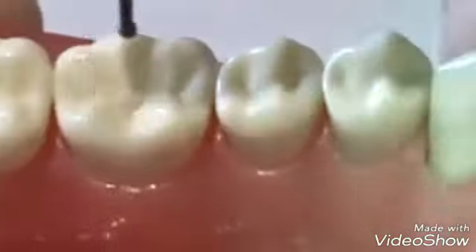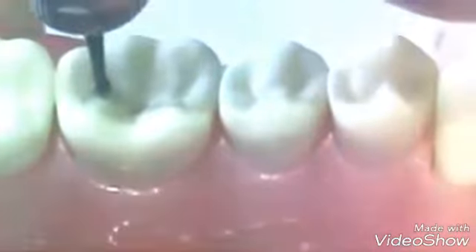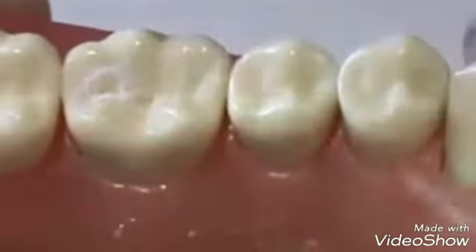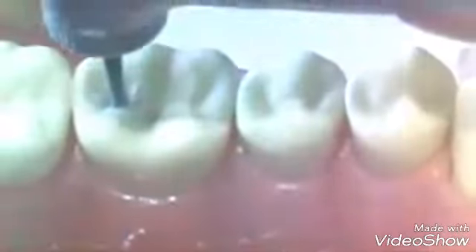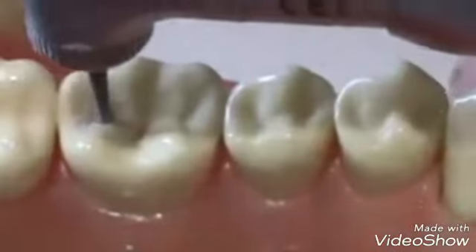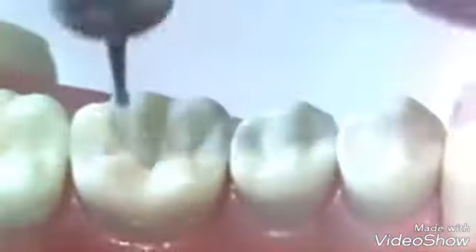We could also place other holes at the mesial and distal fossae to establish a uniform depth.